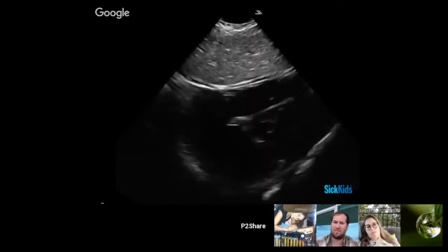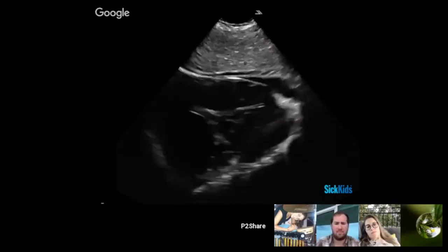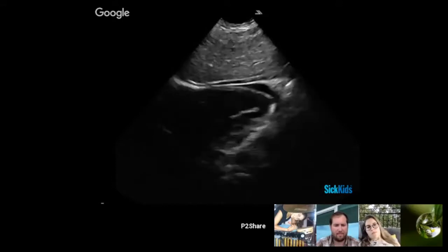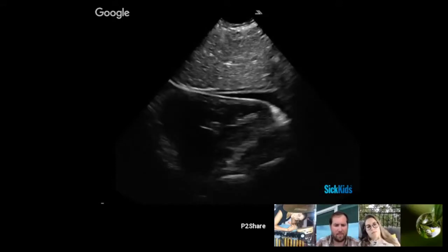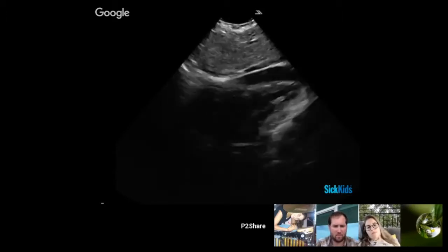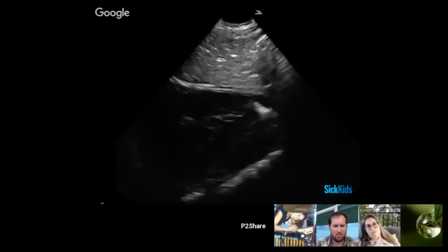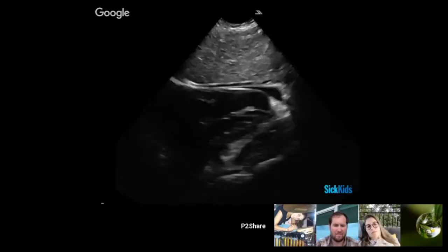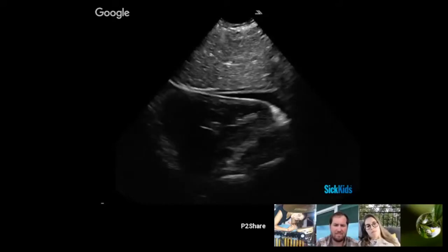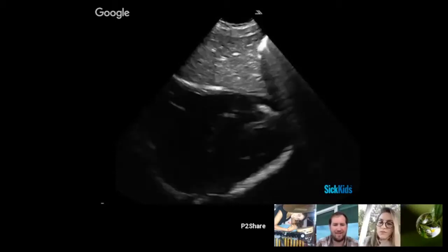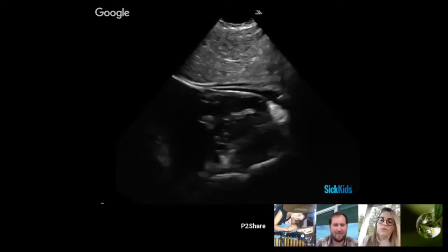You can sort of briefly get a glimpse of the back wall here. This is a smaller effusion, certainly not the same size as the other one. They come in different shapes and sizes, and this amount of fluid looks more generous than you might see with a viral infection, but this is probably not a hemodynamically significant amount of effusion.